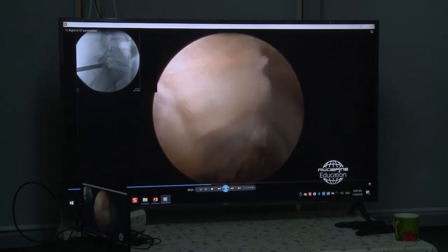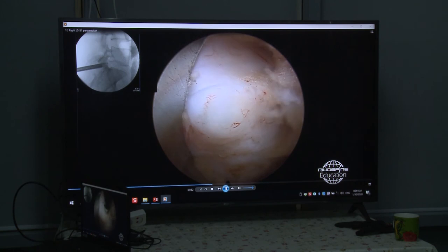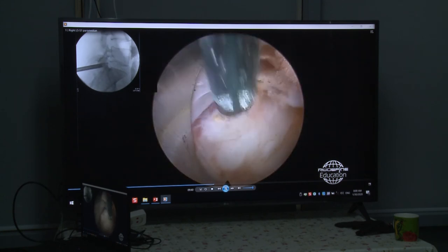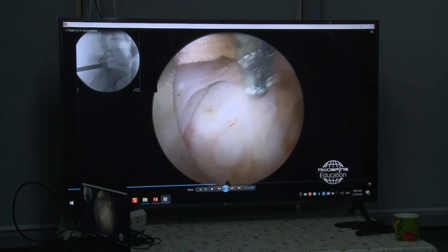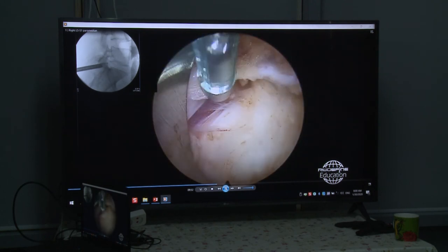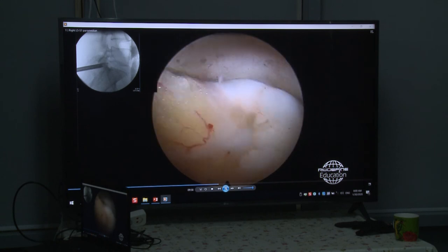So now I go in with the cannula, rotate the cannula, and we see here this structure that is the herniation. Yeah? It's not free, it's covered by the rest of the PLL. And before I open it, I prepare everything very well. So now I look calmly.